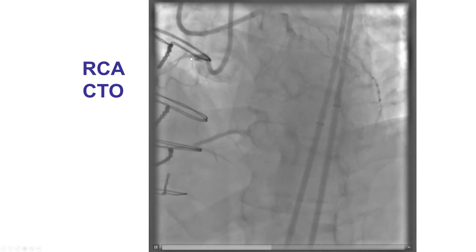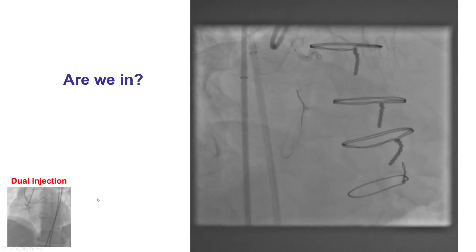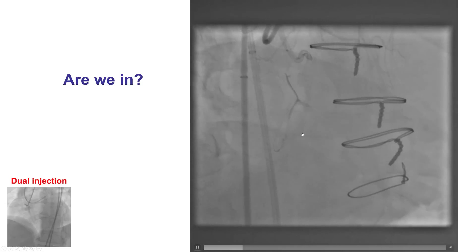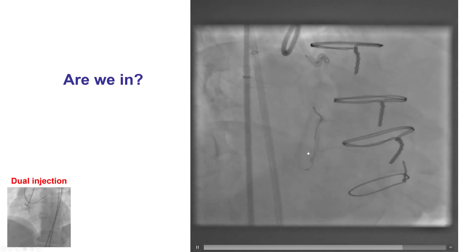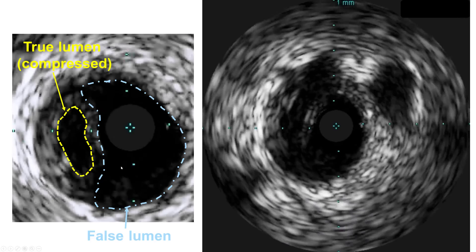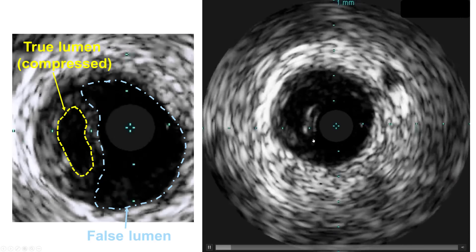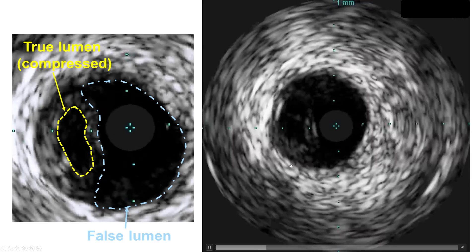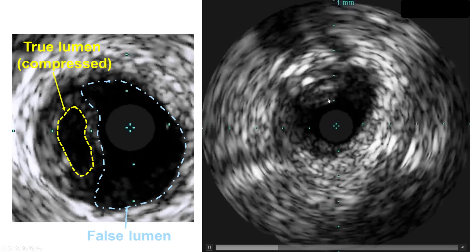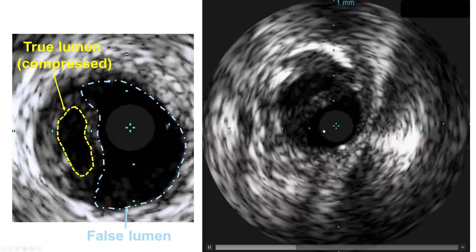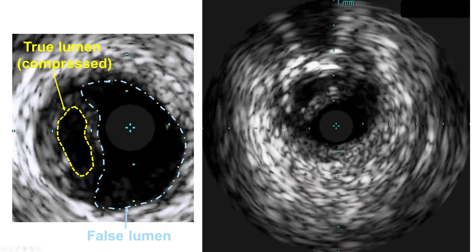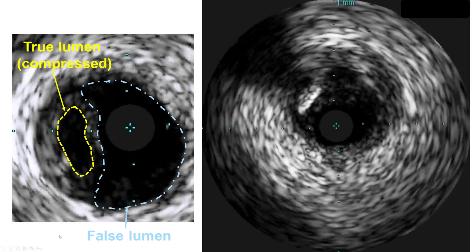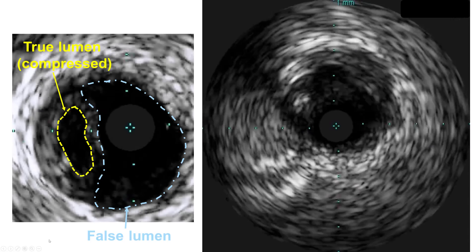This is an example of an ostial right coronary CTO. The CrossBoss catheter was advanced and the guide wire was advanced, but there was still some question as to whether the guide wire was within the distal true lumen. Intravascular ultrasound was done and was very valuable, demonstrating that the distal true lumen is actually here, and the guide wire and IVUS in this case were in the sub-intimal space. Confirming that the guide wire is in the distal true lumen is critical before placing balloons and stents.